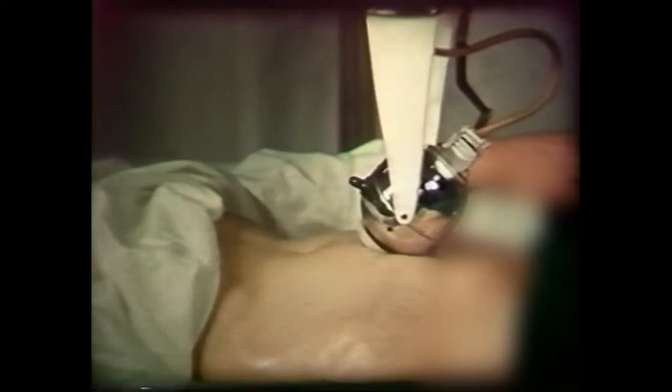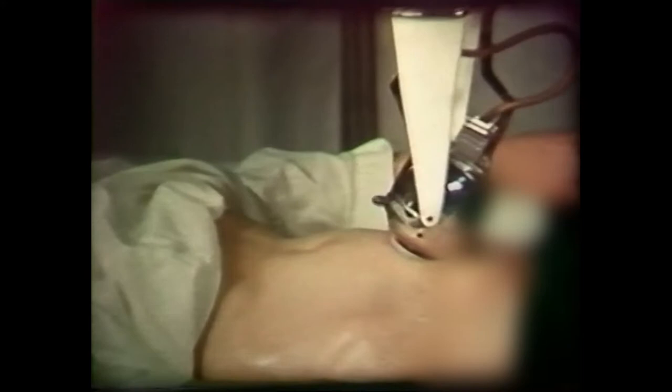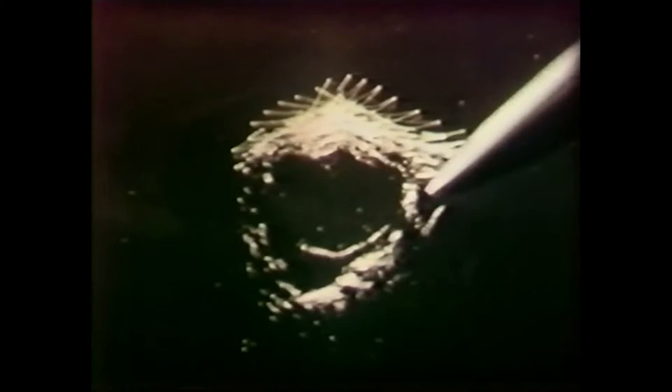This shows the automatic scanner operating in longitudinal section — note how it follows the contours of the body surface. This diagram shows how the picture is being built up during scanning. The completed ultrasonogram of this case in transverse section shows the position of the probe rocking over the surface, and below, a transonic fluid-containing tumor, revealing its dimensions and its posterior wall.